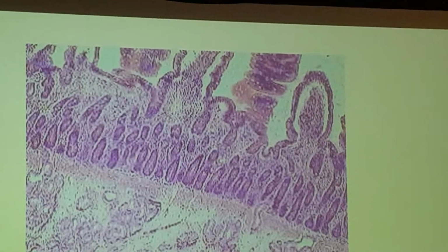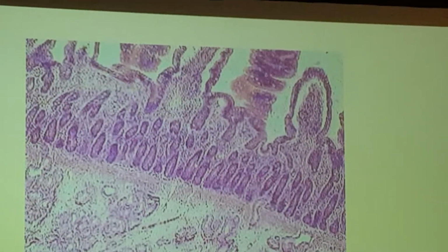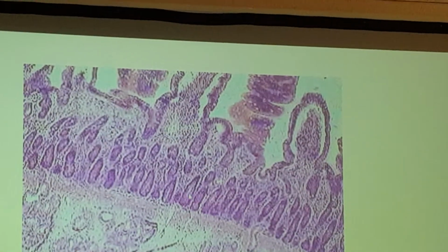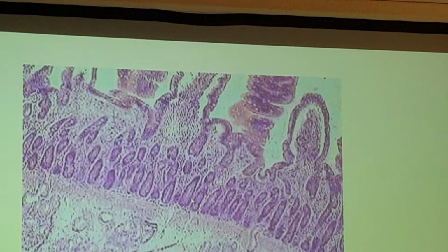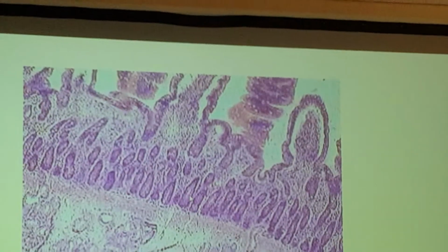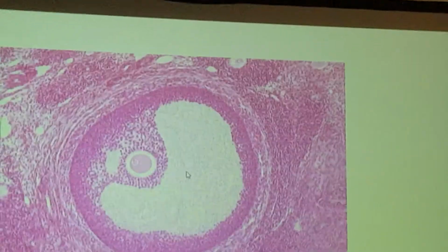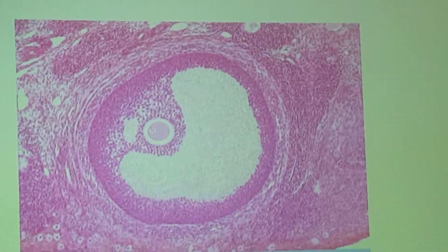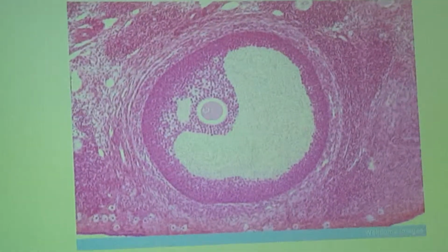Number 3, I pointed right in here and I said identify this structure, intestinal gland. Good? Questions about any of that? Okay. Number 4, I asked you to name the organ, ovary. This is new from today, so if this was harder, this is brand new.